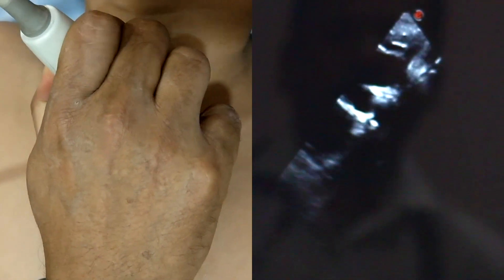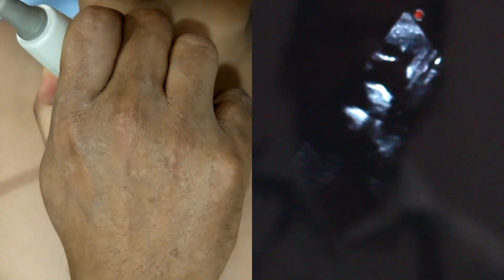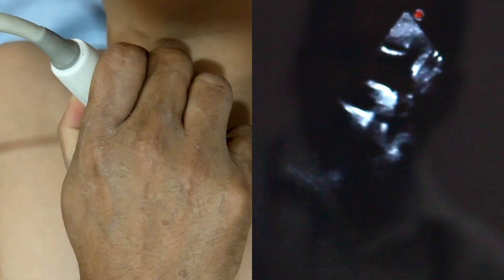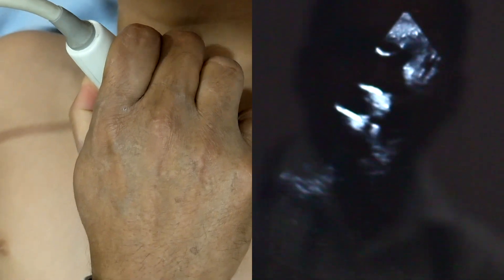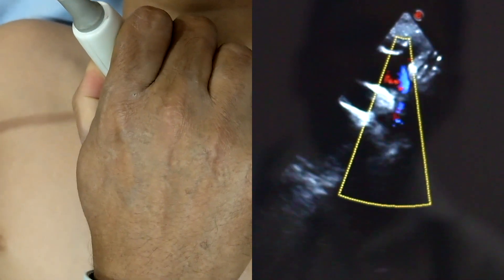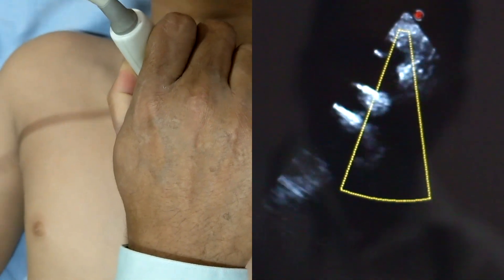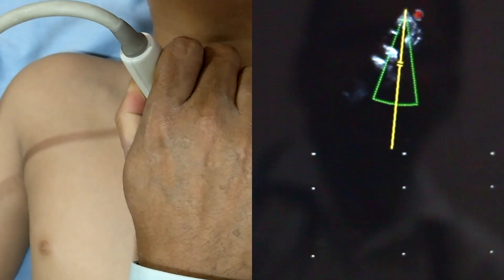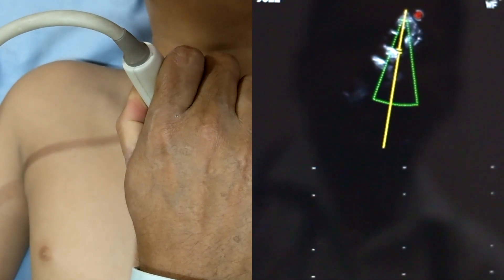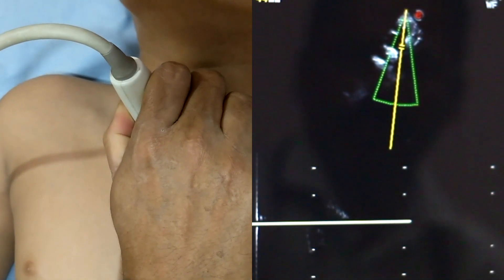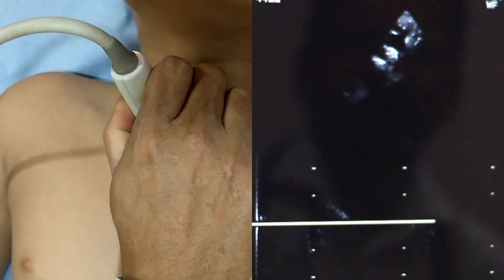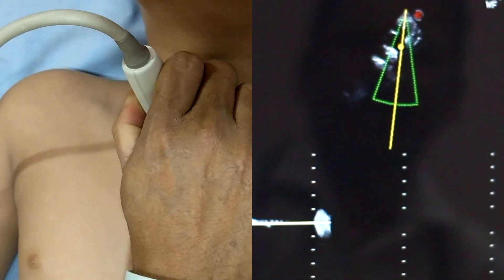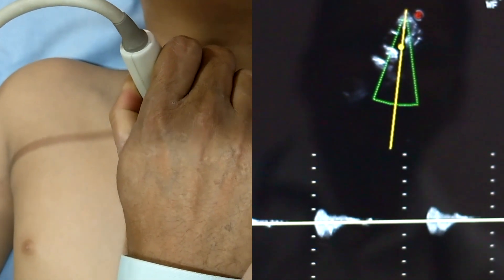This is the supra-sternal notch view. I am holding the probe at the notch level. Here you can see the aortic arch, descending aorta, subclavian arteries — both left and right — and the common carotid arteries.